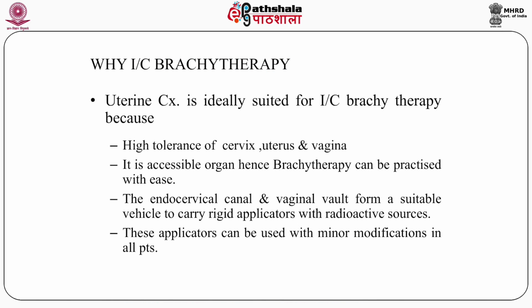Why do we use brachytherapy? This is a very important question. Uterine cervix is ideally suited for intracavity brachytherapy. In the uterine cervix, where the hollow space is there, there is high tolerance of cervix, uterus and vagina.